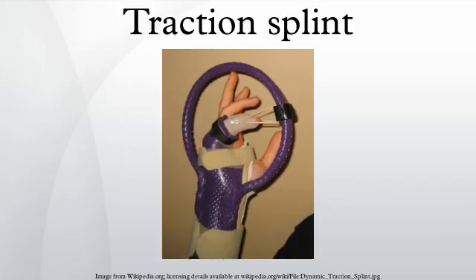The basic principle is that one end of the traction splint is positioned against the hip, and pushes upward against the pelvic bone. A strap around the foot and ankle is connected to the other end of the splint, and tightened to counteract the muscle tension and produce traction. Only then are additional straps added to aid immobilization of the limb.